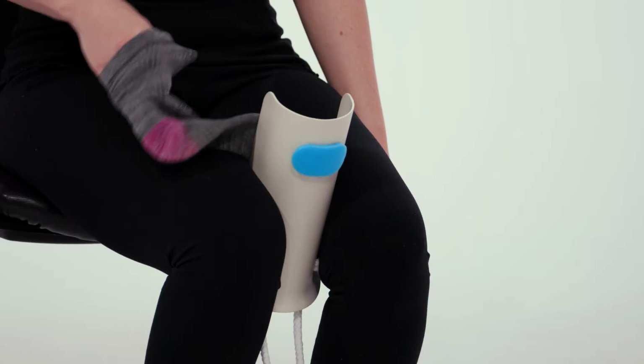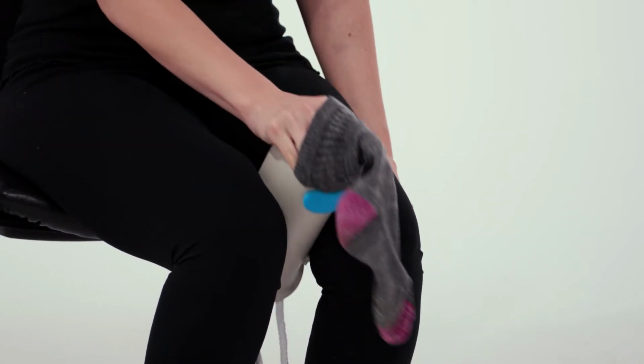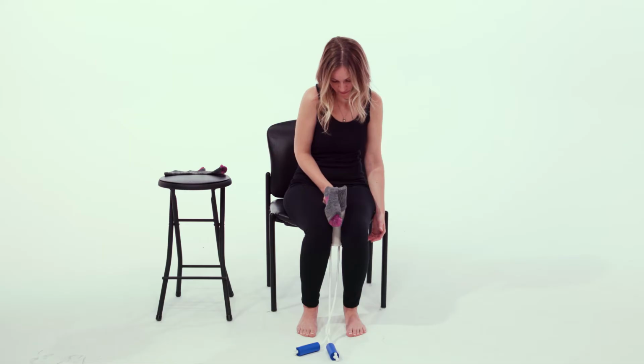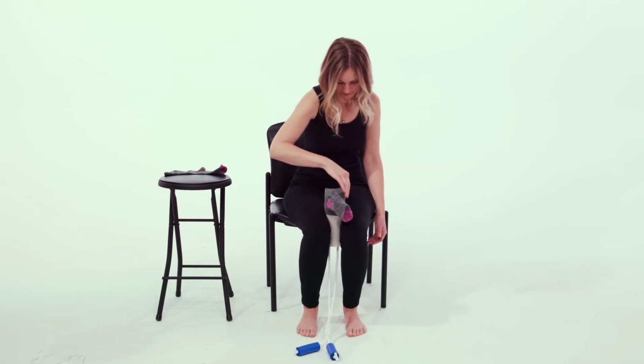With the heel side facing away from you, slide the sock over the top of the sock aid and pull it down. Make sure the toe of the sock is flush against the tool.